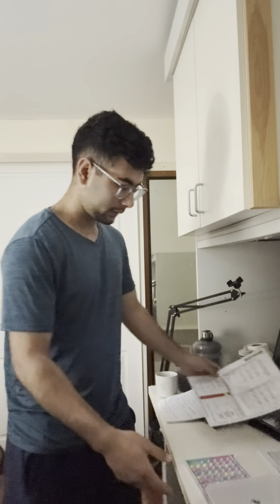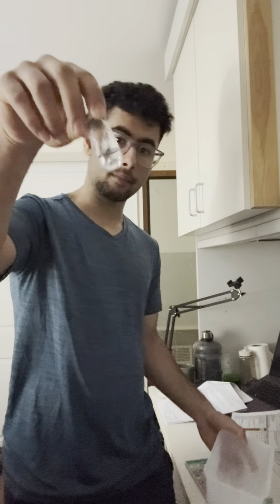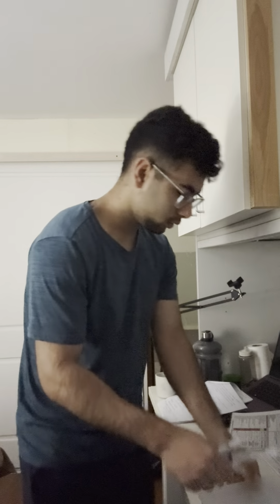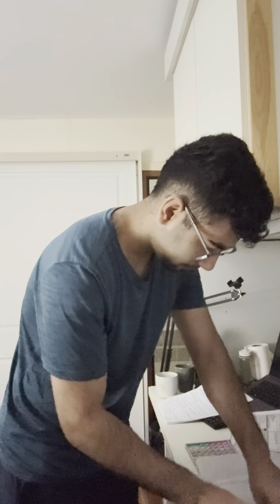So for example, I'm going to gather all the things that I need before I start, right? This is going to take a bit longer because we're going to have to make 3 flushes and also make the medication itself, so it's going to take a long time. I'm going to show you step by step what I need. For documentation we need the VIP score, and the second thing we need is the medication chart. These are the 2 documents we need.